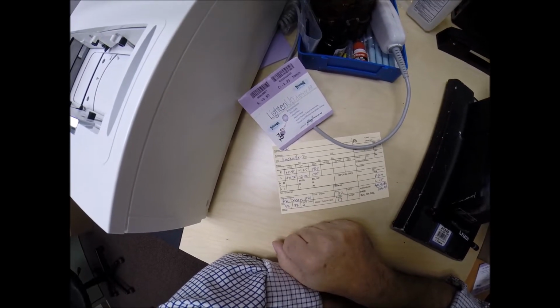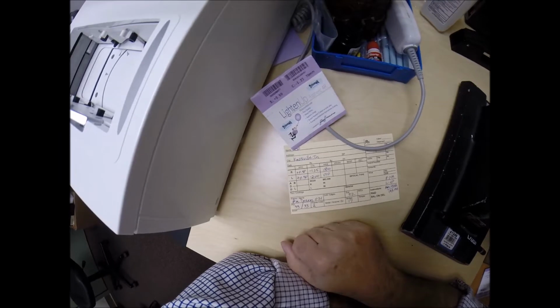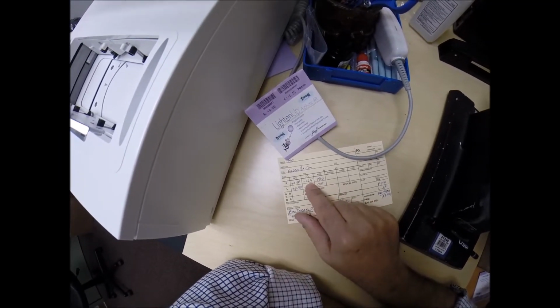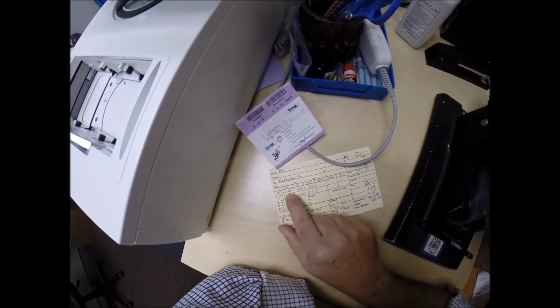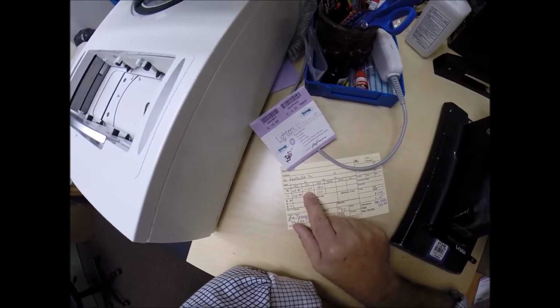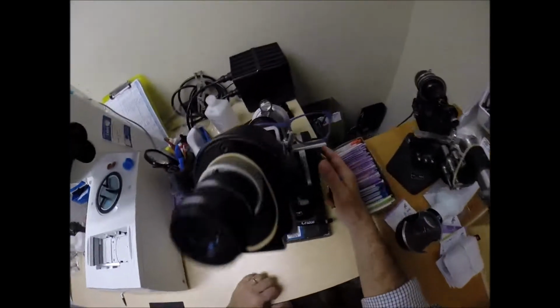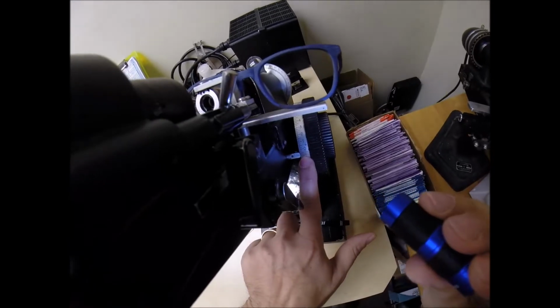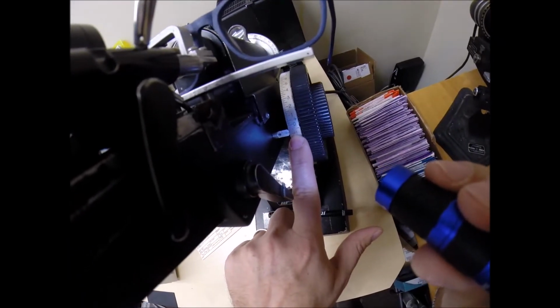There is a stigma over the word astigmatism. It is not a disease. It is not an affliction. Everyone freaks out when they hear that word. It just means you have rough edges. I mean, fuzzy edges. So once everything is the right size, we take away those fuzzy edges, and we're going to spin that wheel to -1 and, well, turn it 1 1/4 backwards, and we end up at -.75, 1 tick mark away from the red 1.